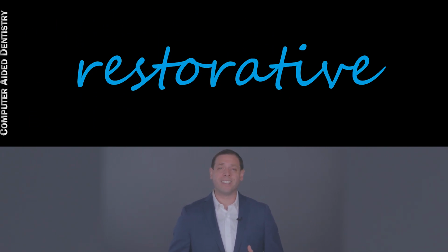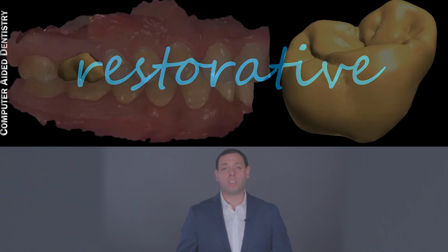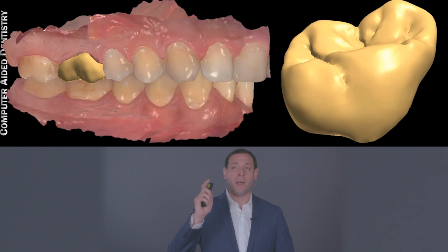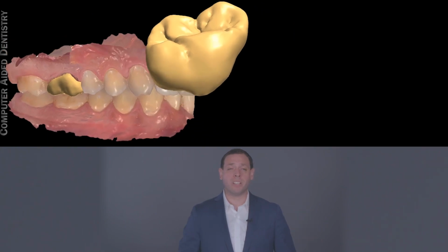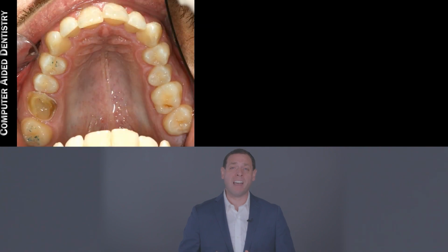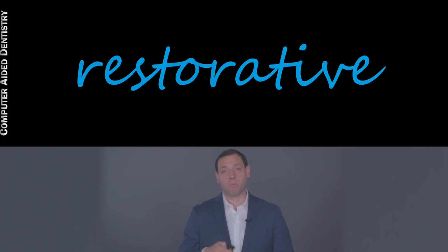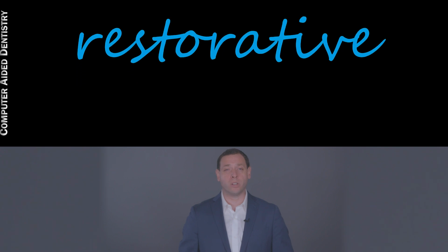And what we've always seen is that these scans, or this digital dentistry, has always been used for a restorative process, but that's changing because of our ability to go ahead and make a restoration within a same day or within an accelerated amount of time. We have the ability to use it for this restorative purpose, and we've had that. But what we're doing now is we're adapting that process to not just be a tool for restorations, but a tool for diagnosis.